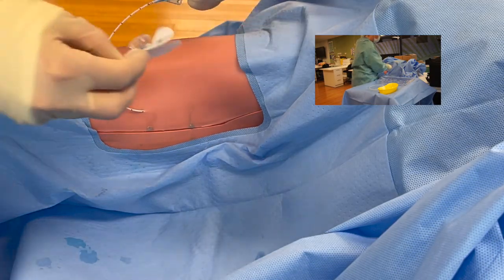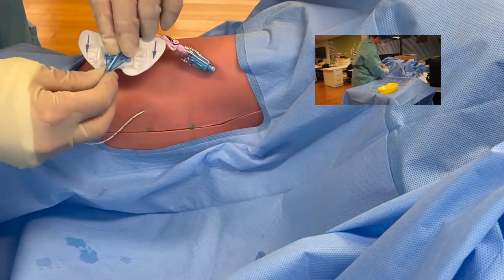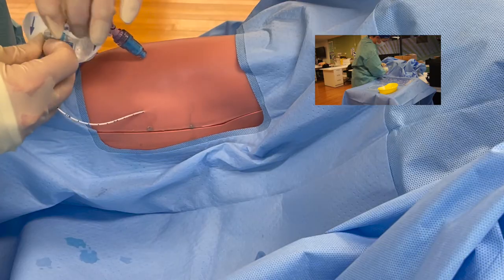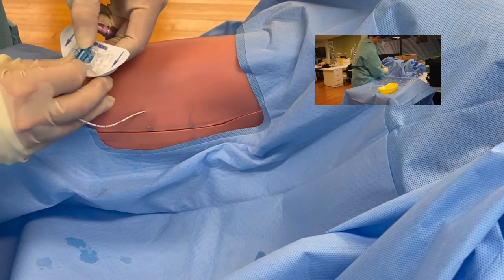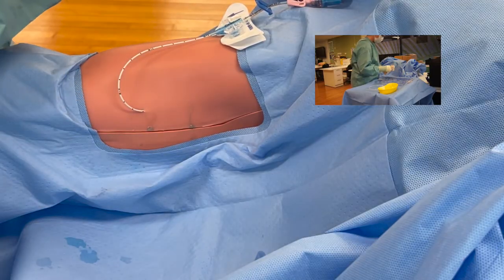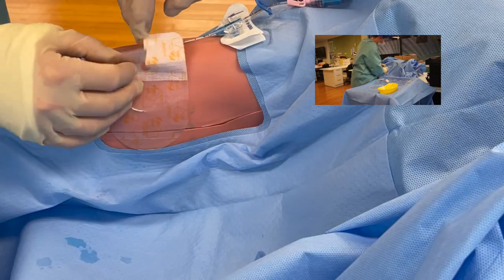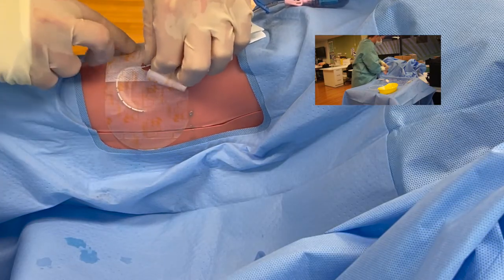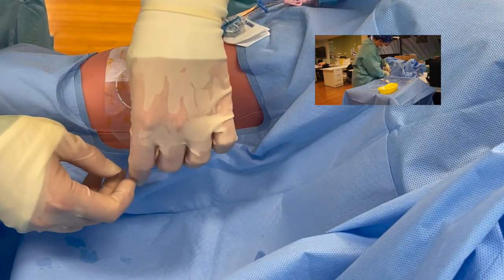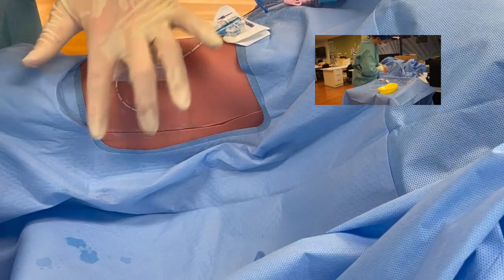You could do one of two things. You could attach your stat lock - the stat lock sits over the two blue components and then just lock into place. Then put that up out of the way of the insertion site. You would take your IV dressing and ensure that your insertion site is covered by the clear part of the dressing, then wrap the wings or legs over the top.